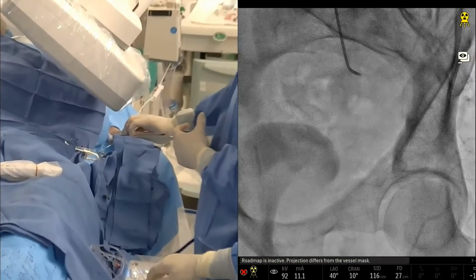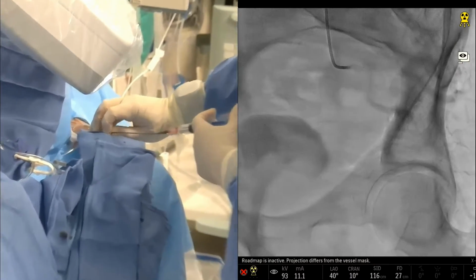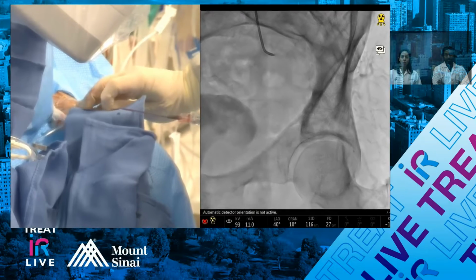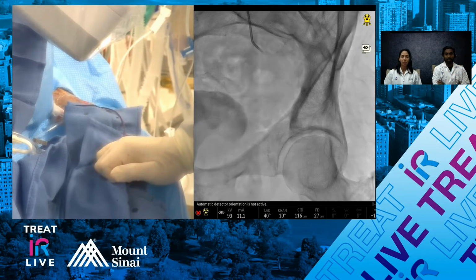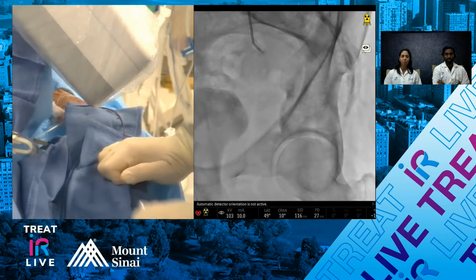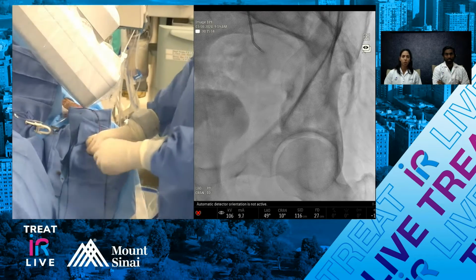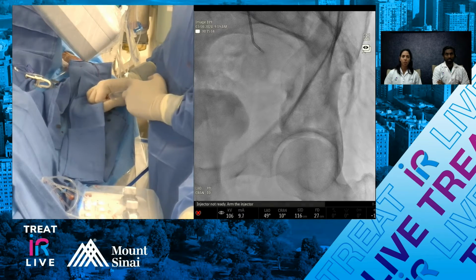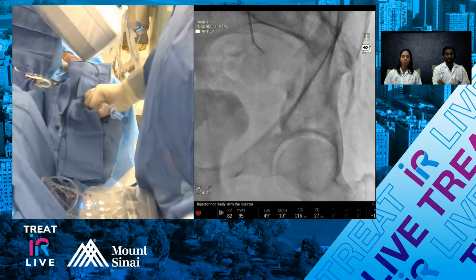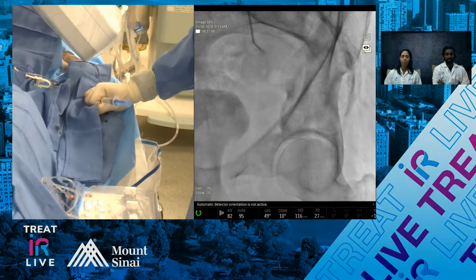Puneet had a great slide showing the escalation approach. So you're looking at this angio, and are you still thinking that balloon occlusion is the way to go, or are you concerned that you may not be able to track it into that very tortuous prostatic origin? Yeah, turn coupling off, Debbie. I think we can get it in, no problem.